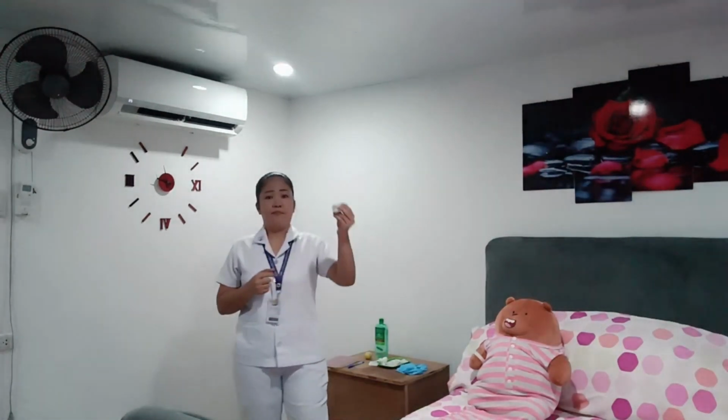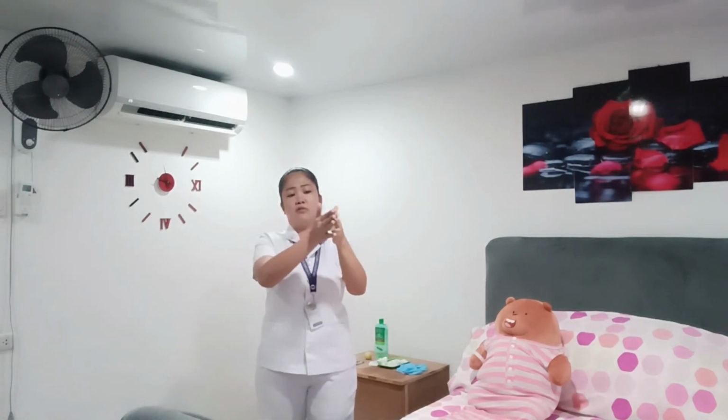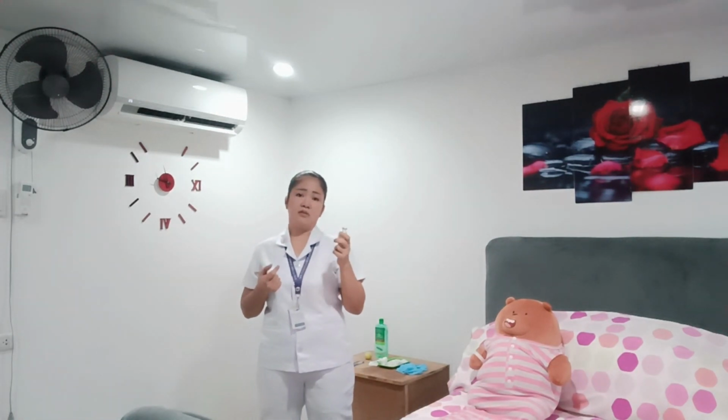Take note, if you're mixing the meds or the vials, you don't have to shake it like this. You cannot shake your medication like this, as it could possibly fall. Instead, use both palms and do it like this, just rotating it. Remove the cap on the vial, which mine is already removed. So what I should do is clean it with antiseptic from inside to outside in a rotating or circular motion.